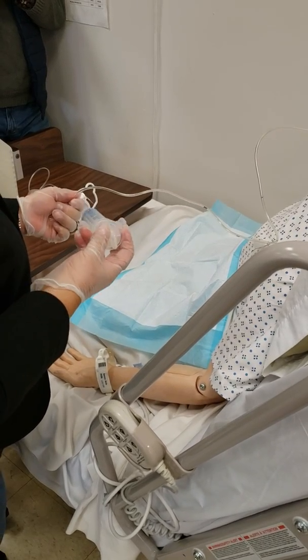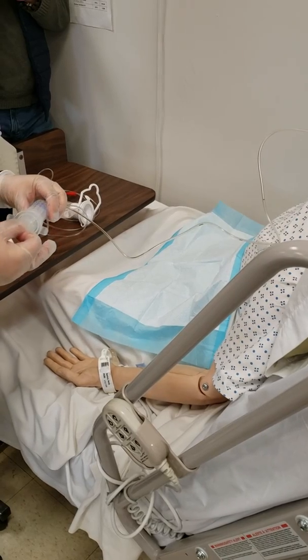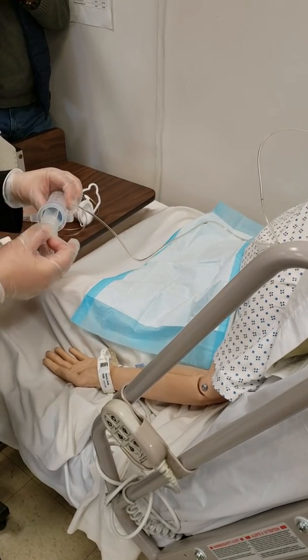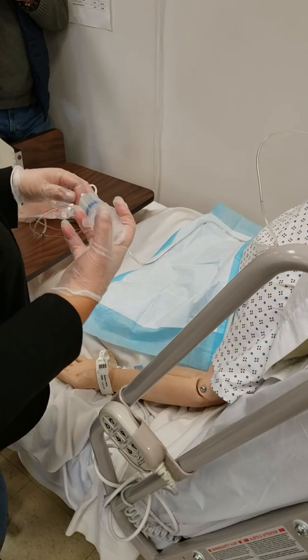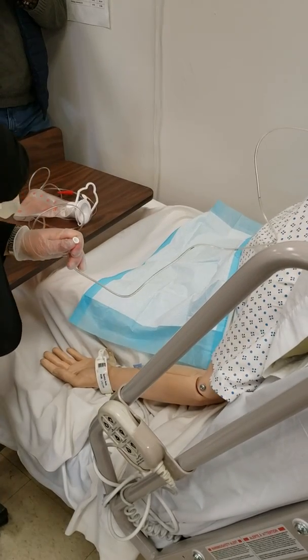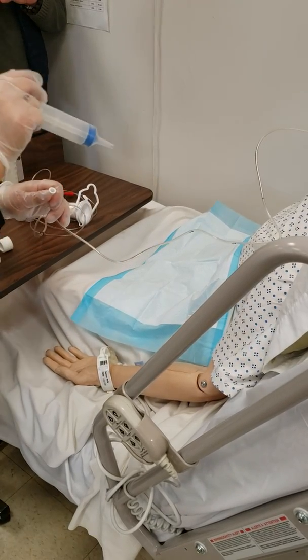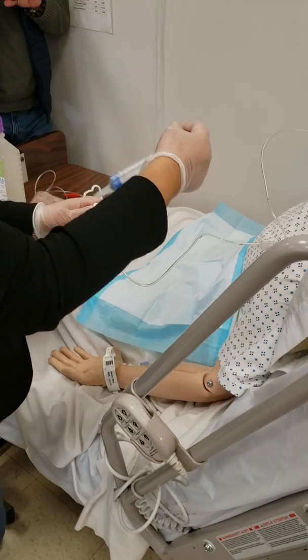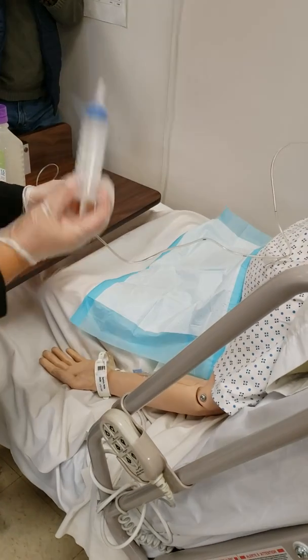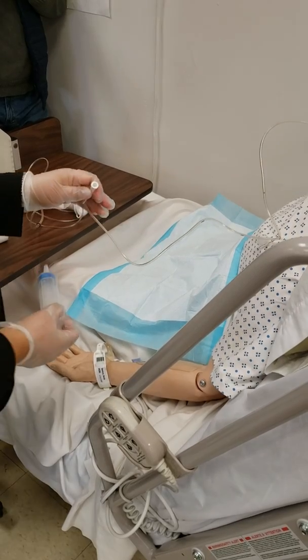So if everything is fine, you tell the teacher, I aspirated, it's only 60 or 50, and that's fine. I will push it back a little bit and get a little bit over here and check the pH. And it's normal, it's acidic, so the tube is in the right place.